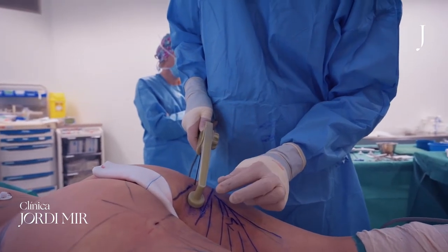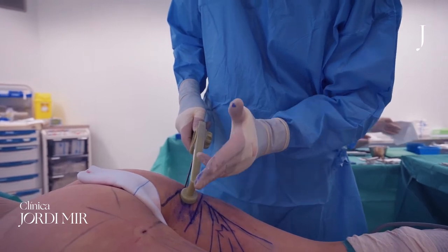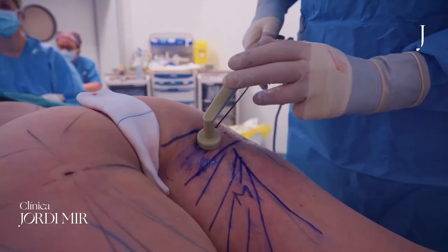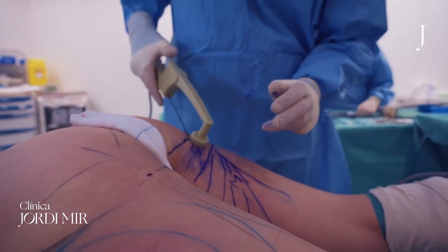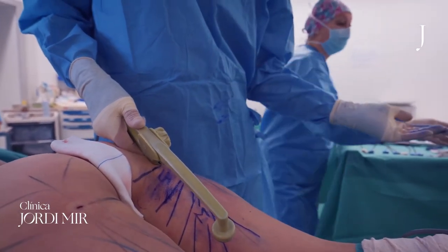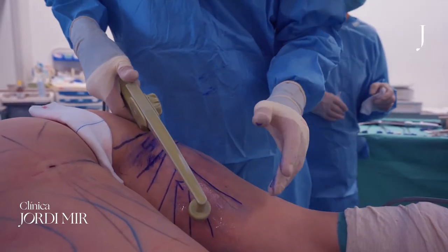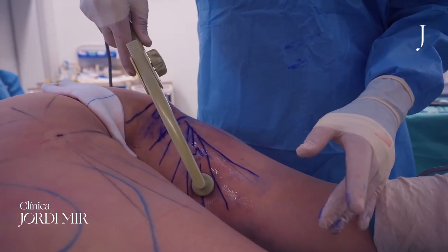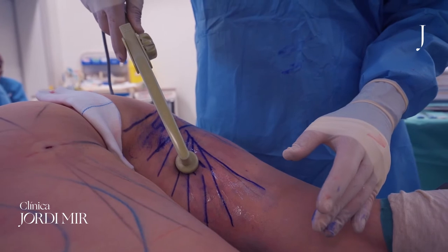With the stamping we go here and here, because we want to mark the infragluteal sulcus. And in the moving, we want a retightening of the skin with a lifting of this zone. We go very slowly, around one centimeter per second.